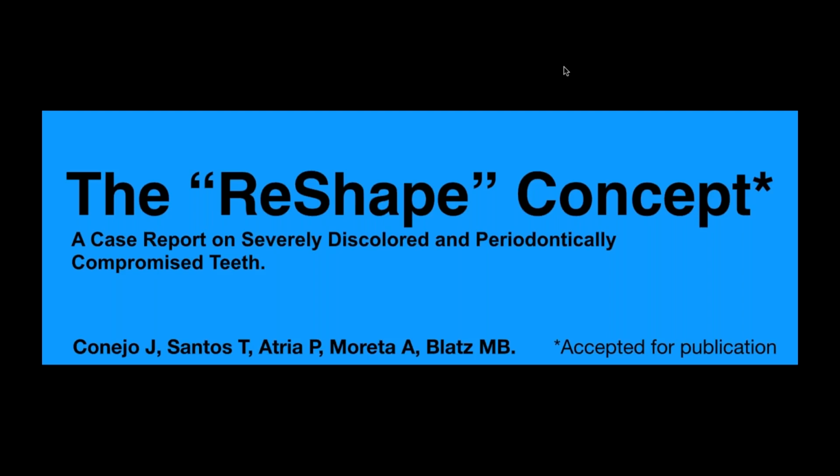And we just published this in Compendium magazine for April. You'll see it there. It's what Telmo called the reshape concept, and basically it's a technique to clone texture, but respecting some of the guidelines that the clinician wants on the restorations when we design. I think that we as clinicians know the patient better because we pack the cord, we can feel how that tissue is being displaced. We want to have certain pressure in certain areas, and if the technician is just working with a resin printed model or a stone model, he doesn't have that information.